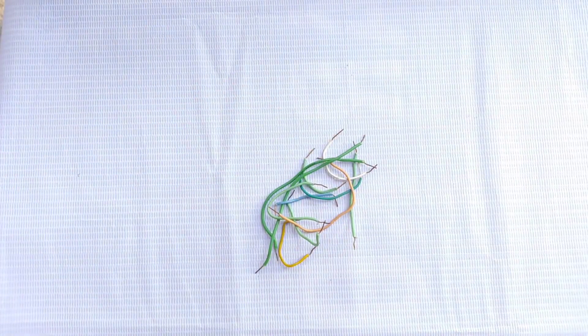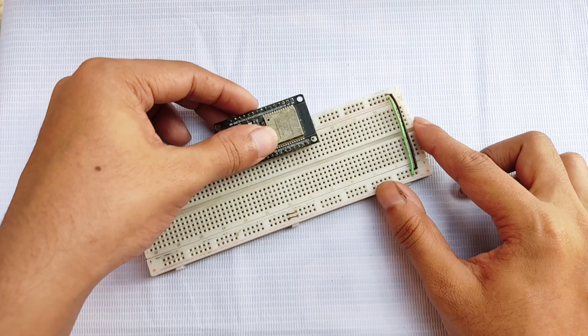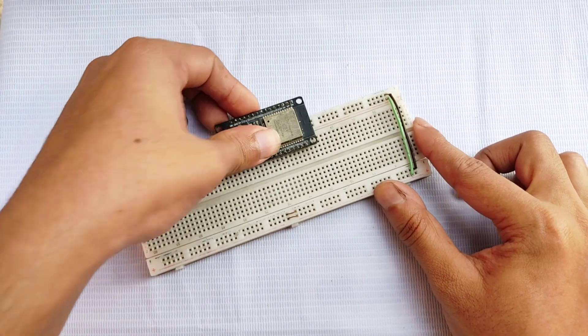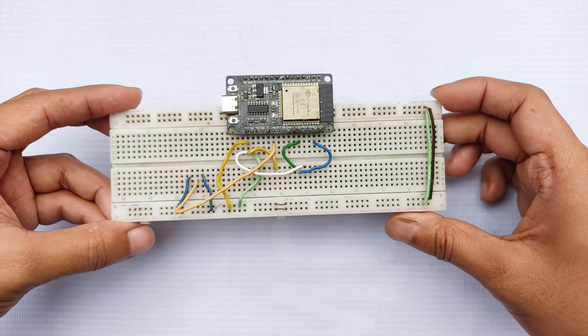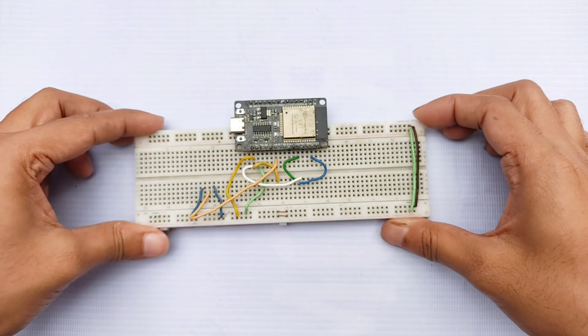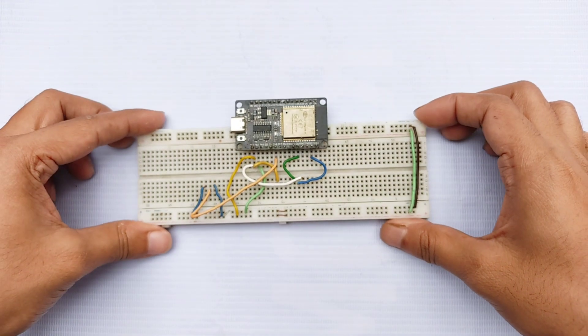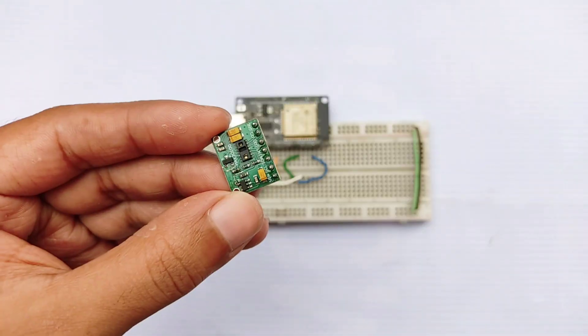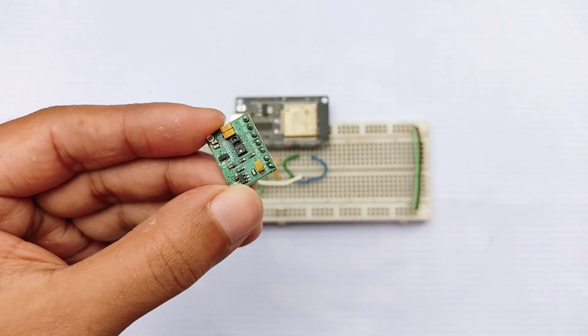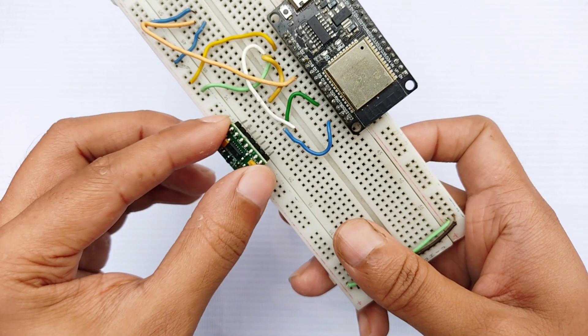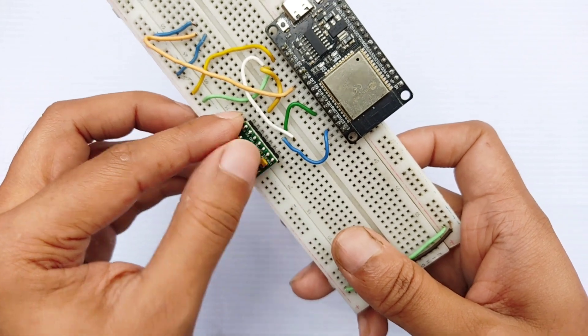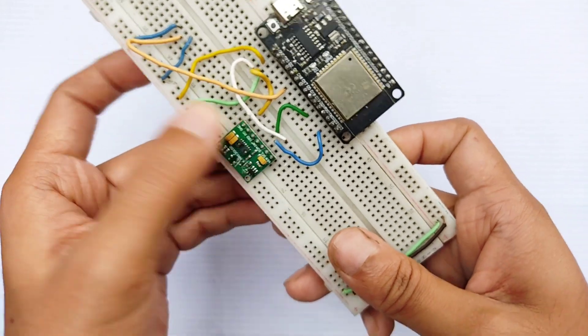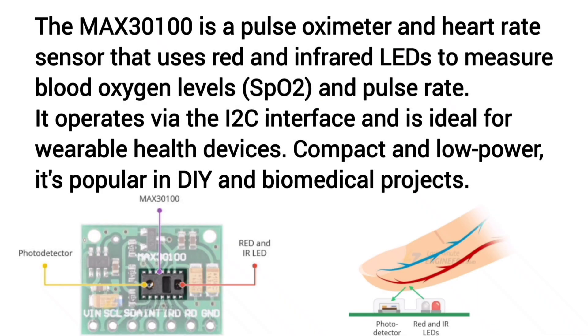Begin by placing the ESP32 onto the breadboard. Next, connect the jumper wires on the breadboard to connect all the modules as per the circuit diagram. Then, place the MAX 30100 sensor on the breadboard and connect it to the ESP32. The MAX 30100 uses red and infrared LEDs to accurately detect pulse and blood oxygen levels.